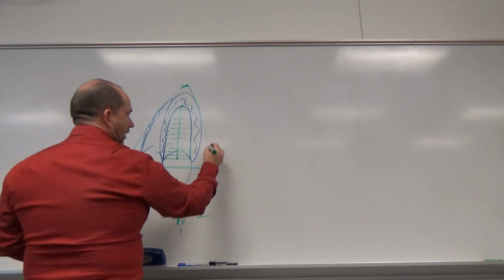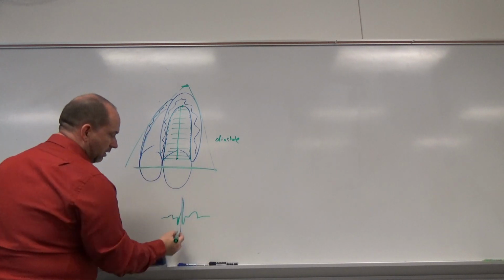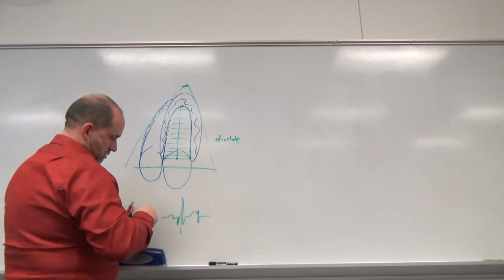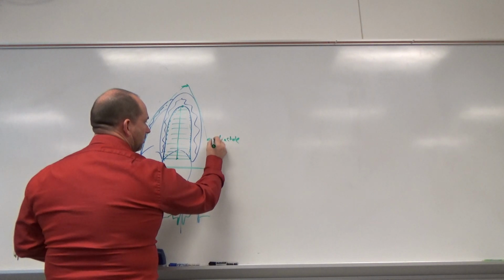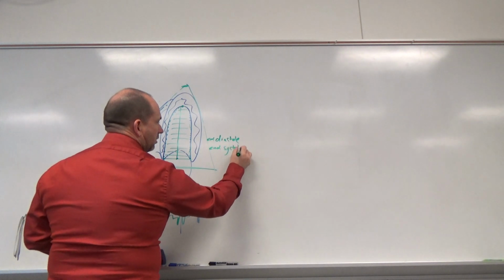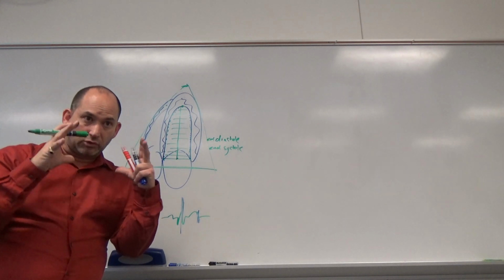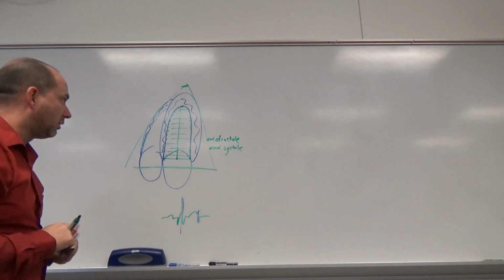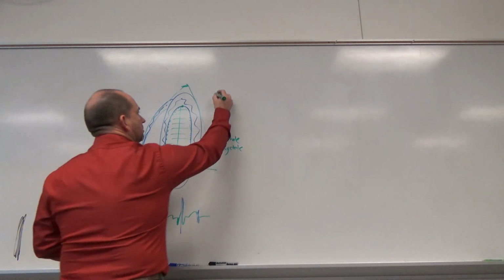So we do this first in diastole, on the R wave, then we do it just after the T wave, that full systole, the very end of systole. So this is end diastole and end systole. You do it when it's maximum volume, so you're going to scroll back and forth, and then squeeze it in until it's the smallest, and you're going to measure at that point as well and compare those two volumes. Simpson's method of discs is what this is called.